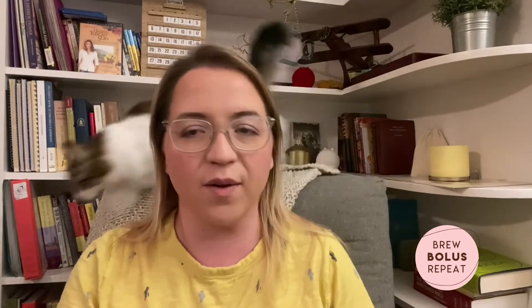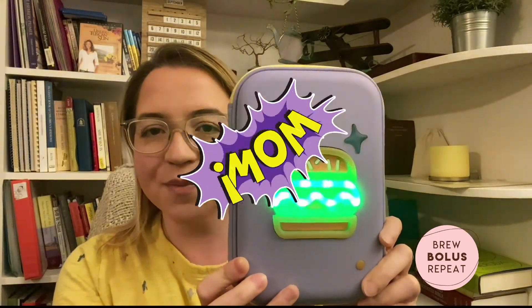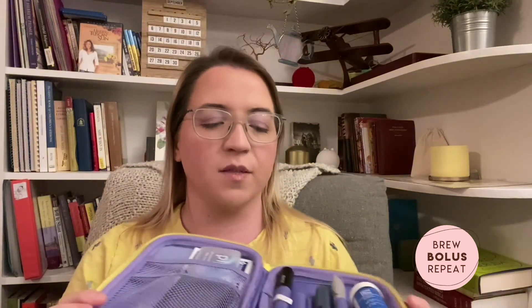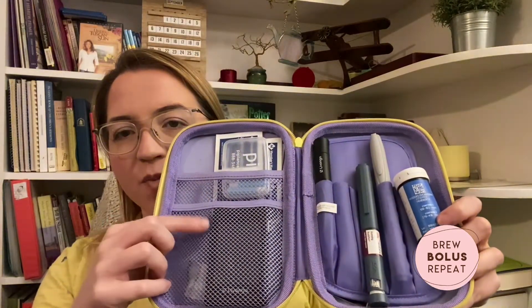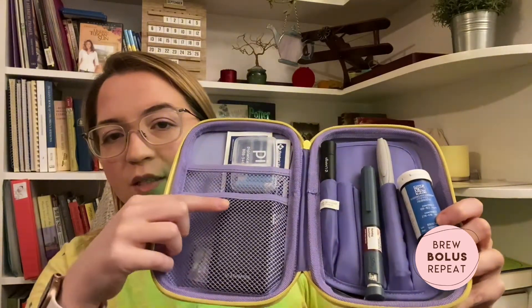I recently picked up this case that I carry everything around in that I'm very proud of. It's a light-up hamburger case that I found at Target. It's supposed to be a pencil case but it's just the right size for all of my diabetes supplies. It's got some little pouches — I keep my blood glucose meter on this side and my pens over there. You can see I've got my lancing device in there as well.